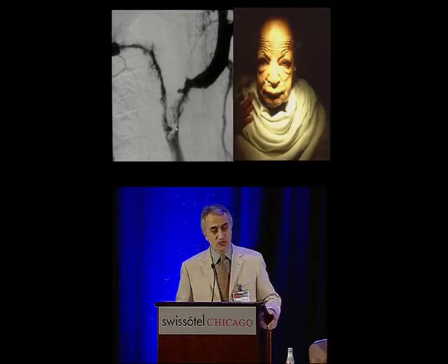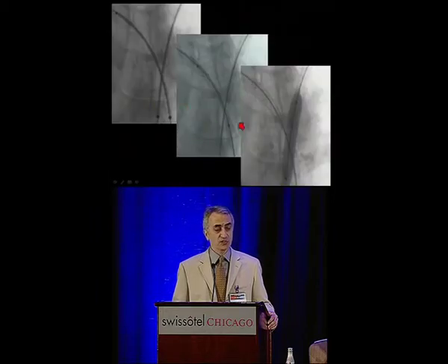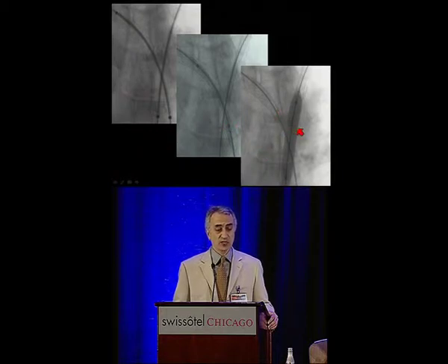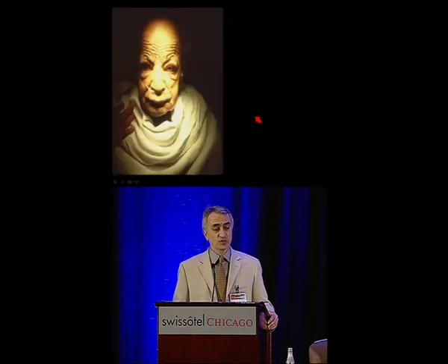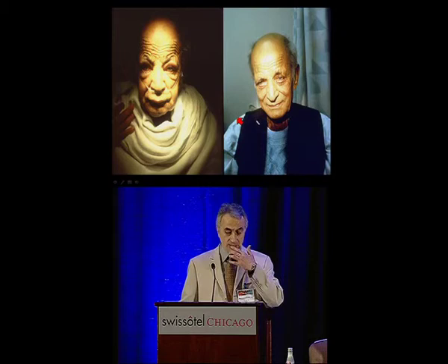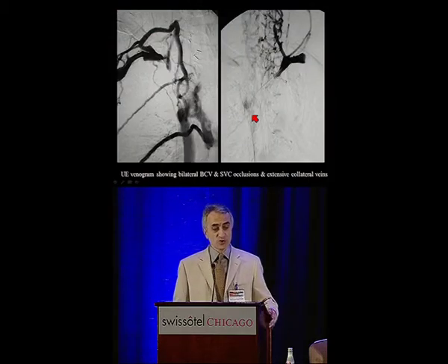And you know it's an old case by the way we treated it. You'll see it. This is post-thrombolysis. The patient has had radiation. This is a typical sort of scarred down vein after radiation with chronic clot component. This was treated by sort of a double-barrel SVC, which I don't do particularly with the wall stents anymore. And flow was reestablished, and of course, you see a significant improvement in the patient's condition. That's the way we used to do it in the 90s.